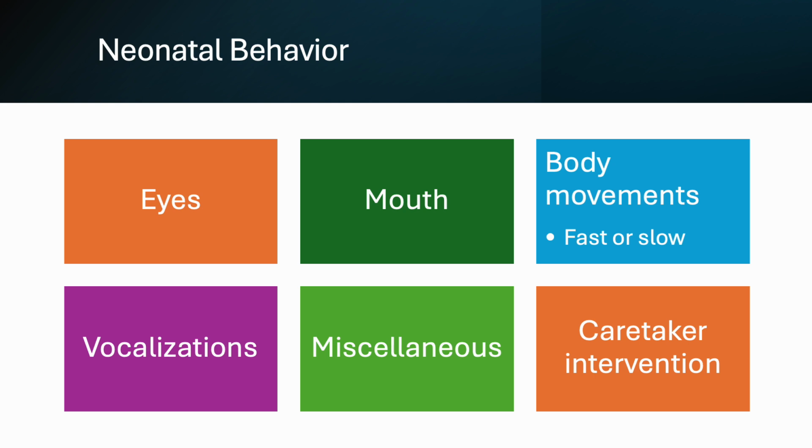As far as vocalizations, crying, whimpering, cooing and grunting can be seen in the snore microphone deflections. Other things to note would be sneezing, coughing, hiccups, yawns, burps, regurgitation, and flatus, or farting. Whenever the caretaker has contact with the patient, document everything. You have to document these things not only because the doctor can't always see what's going on when they're looking at the study on the video.